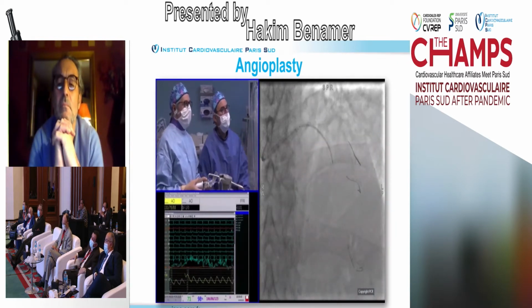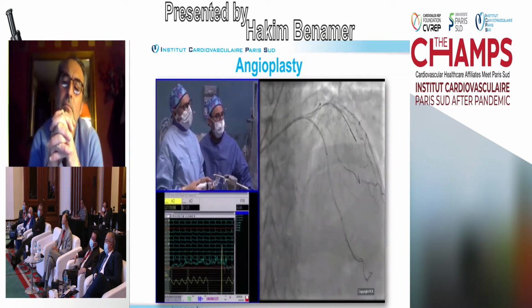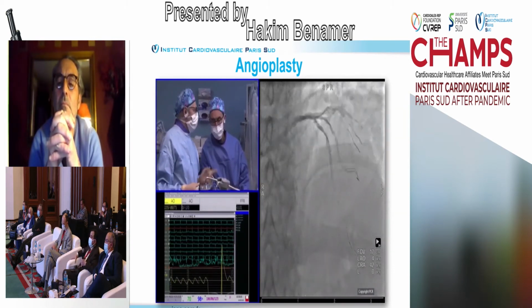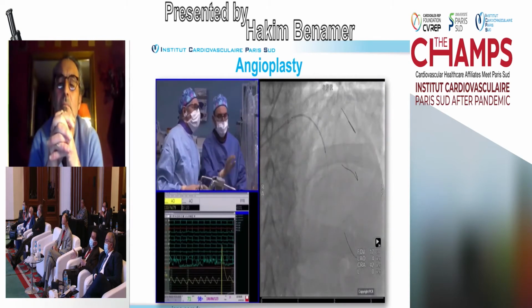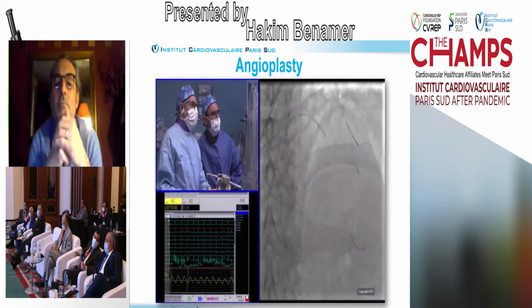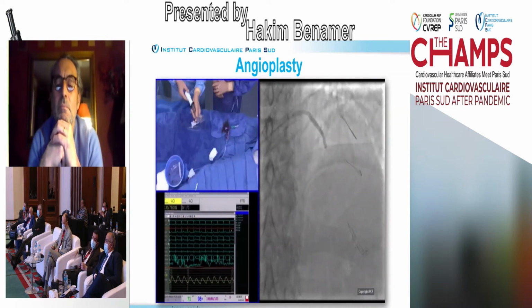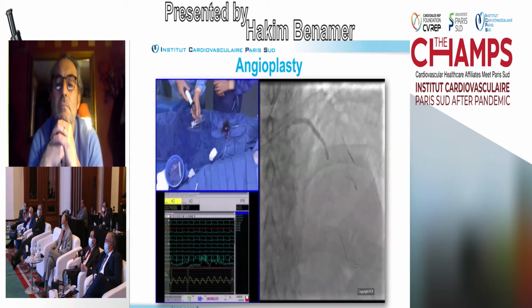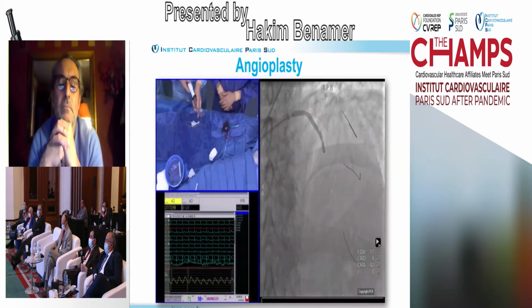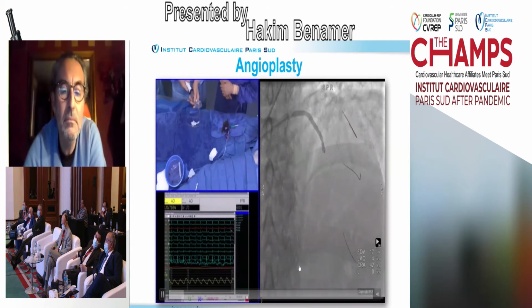The audience will be seeing the stent deployed any moment now, but are you comfortable with the strategy based on the imaging and the extra physiological information? Yes, I think I agree with the single stent that you originally planned, as it is a bifurcation, and maybe we end up with a single stent. Right, it gives you more options potentially.